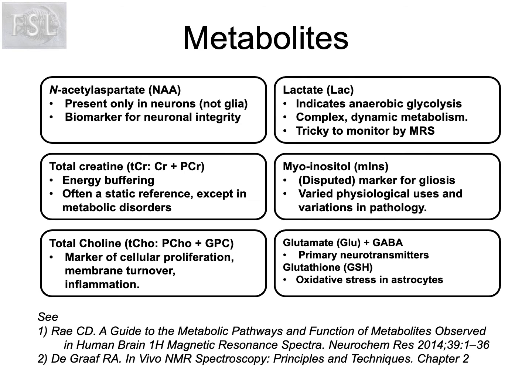With such an array of signals, it isn't surprising that the interpretation of information gained from MRS is complicated. And whilst many studies only focus on a few of the most prominent metabolites, the understanding of the uses and compartmentalization of those metabolites is still incomplete or disputed. Different brain regions, different subject age, and pathology are all likely to affect the interpretation of changes observed in spectra.